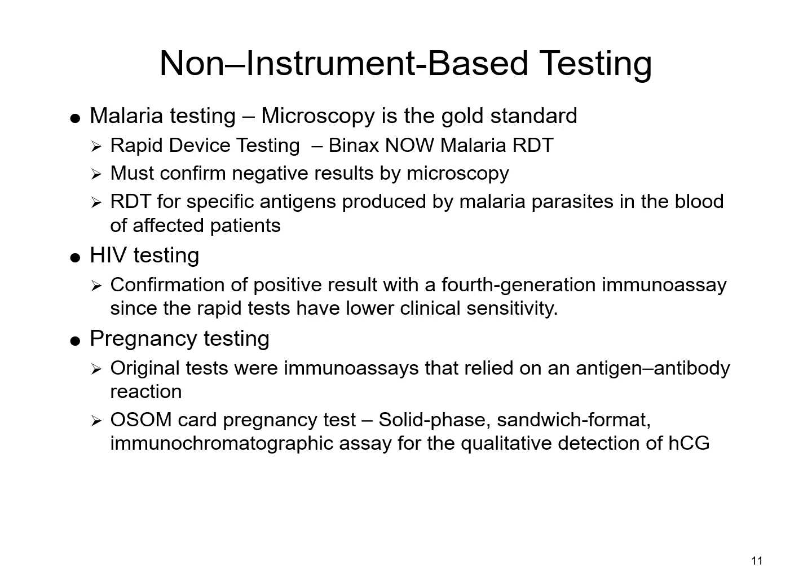Obviously, as with any test, you do have room for error. So these particular test methods require that if the test is negative, you must still make a slide and confirm it microscopically. My personal opinion, if I've already got to make a slide when it's negative, I might as well just do that in the first place and look at it.